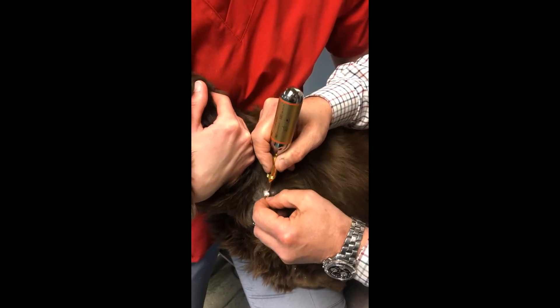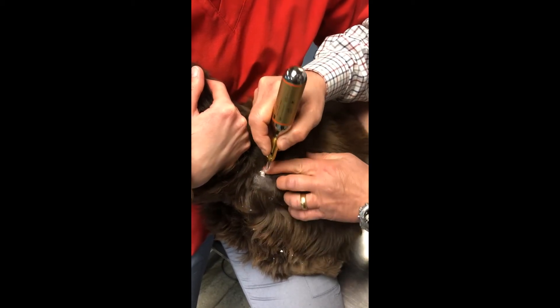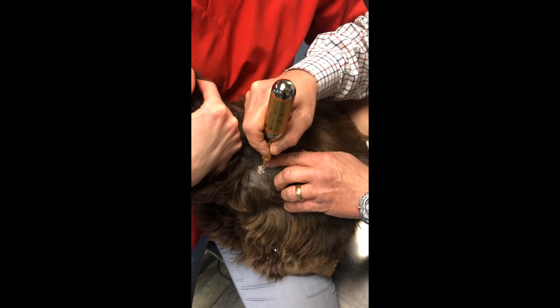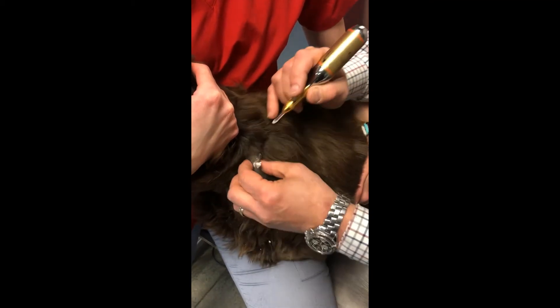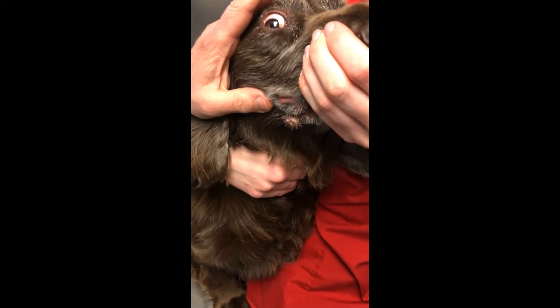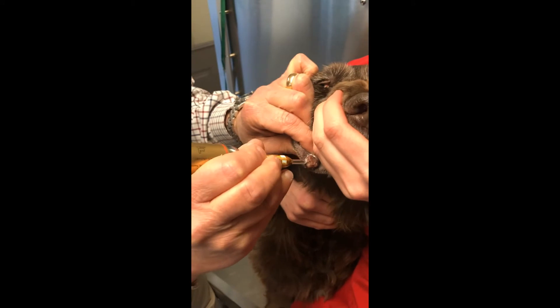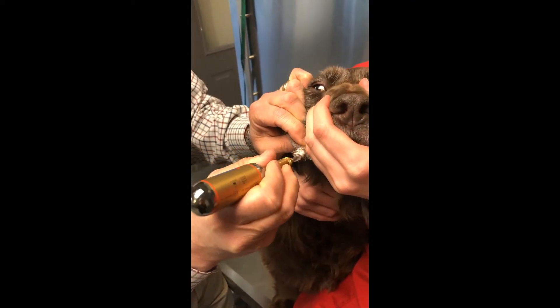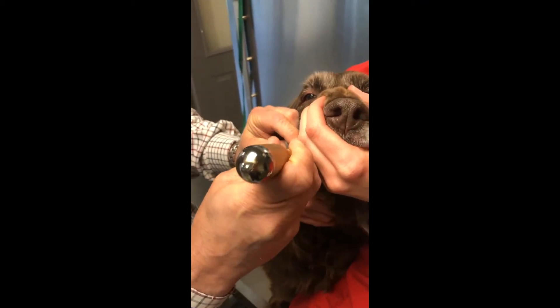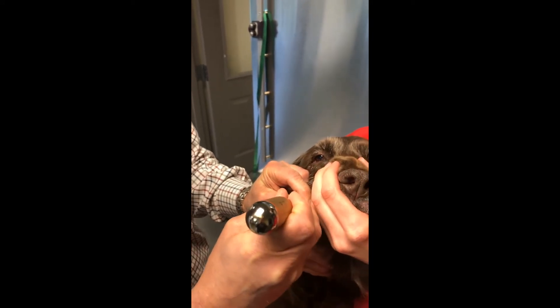We want the mass to have as quick a freeze cycle as possible. This is the mass post-thaw cycle and we're going to again start at the base. We are using the D3 tips and we're going to freeze this mass in a uniform manner, knocking off the ice crystals as they form.